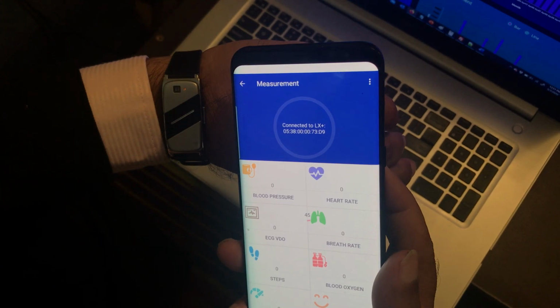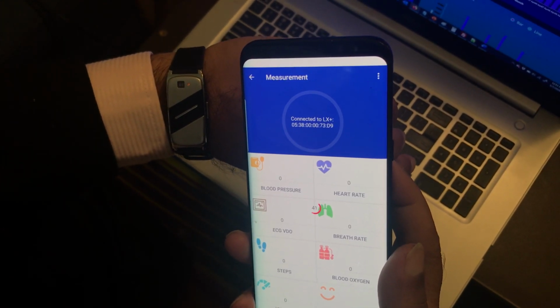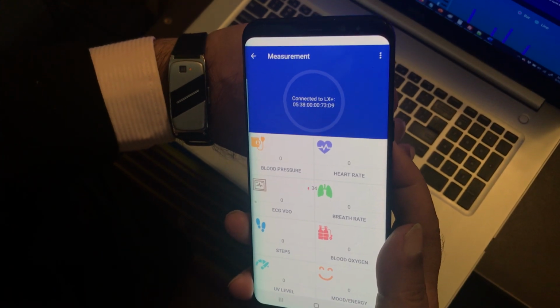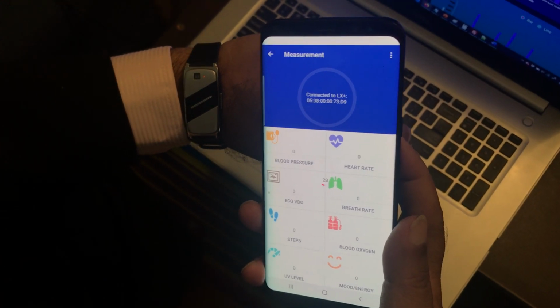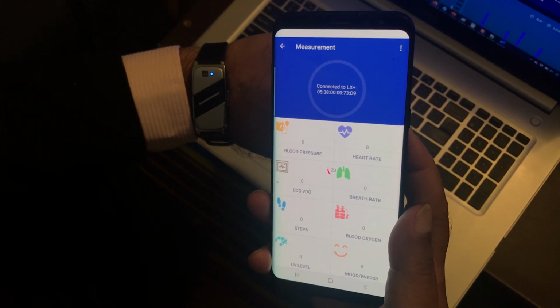Very soon, in about 40 seconds, you're going to see the blood pressure and how it is going to work through, and additional parameters like the mean arterial pressure and subsequently the pulse pressure, you are going to see on these screens as well. So another 20 seconds and you would have the output.